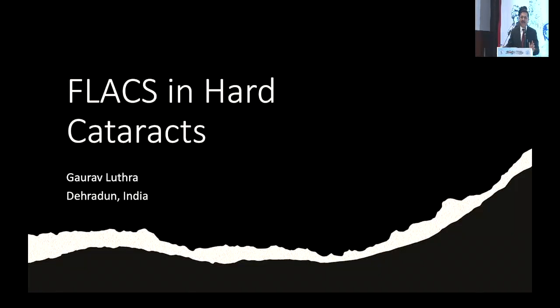LRIs were not very great with a diamond knife. We have done that in the past, all the various nomograms. But with the various machines that we have now, the Callisto, the Varion, makes life a lot easier to plan in the majority of cases. Again, in the interest of time, thanks for sharing your views on this.